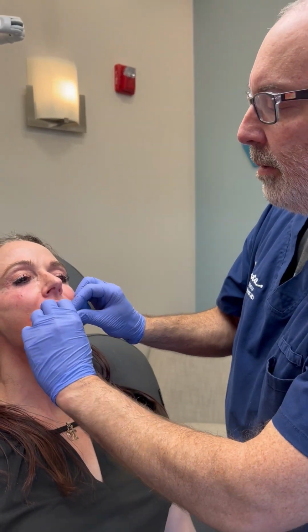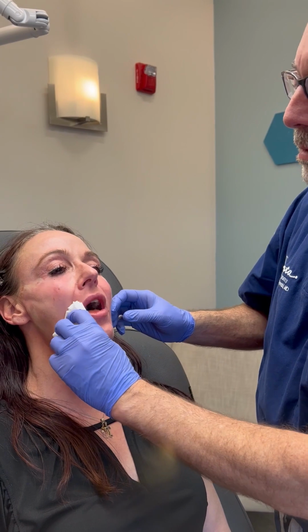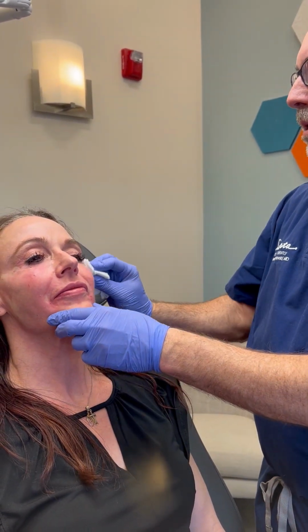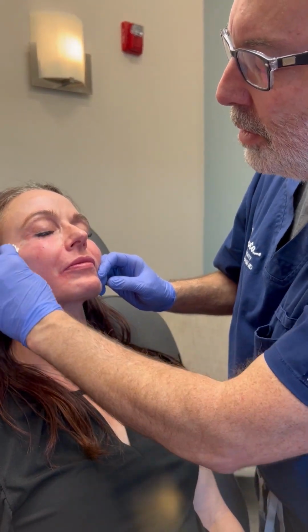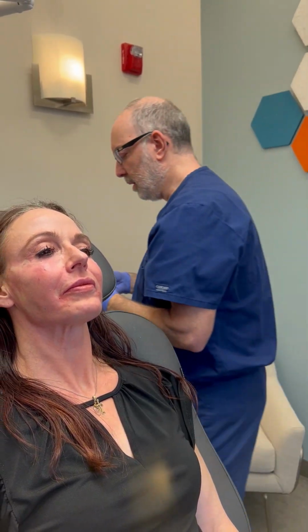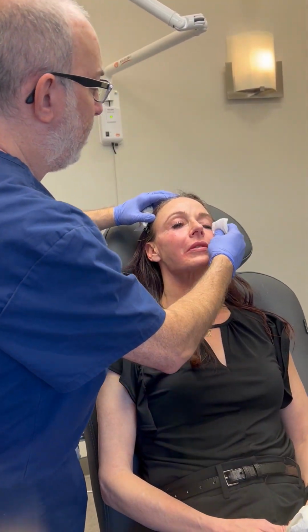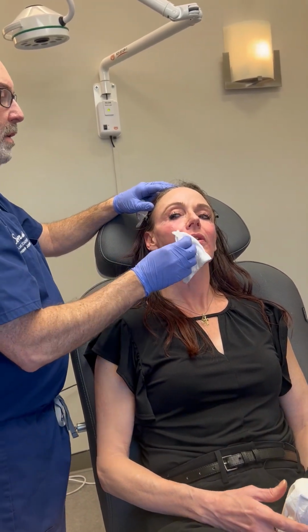So I'm done. Yeah, very little bleeding here. And we usually don't see much bruising with Sculptra or these cannula procedures. Okay, good. So good. I'll let you take a look. If you feel like the lip is enough, then we'll stop there.